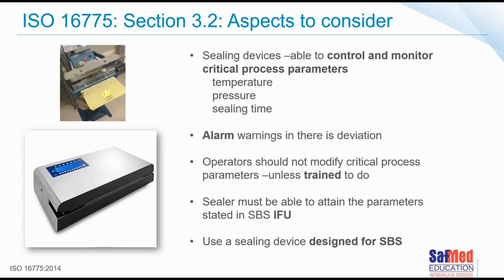The sealer you buy must be able to attain the parameters stated by the Sterile Barrier Systems instructions for use. So obviously it must be able to attain those temperatures, for example, or that dwell time.